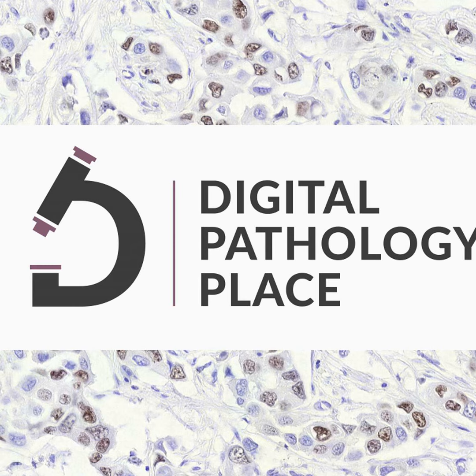They had a problem with pixel count. Does not surprise me, because when you just count positive pixels, you may have inconsistent background, non-cellular elements staining, and artifacts increasing variability of the positive pixel method. But the AI-driven method was better at identifying pathological changes associated with sparse pathology.